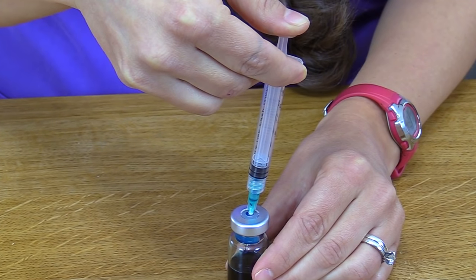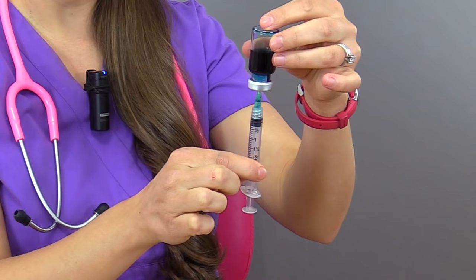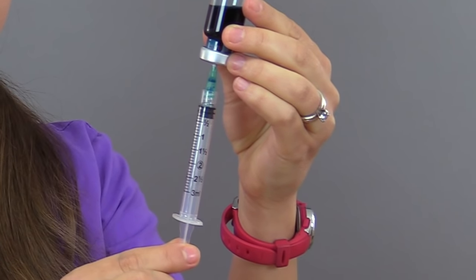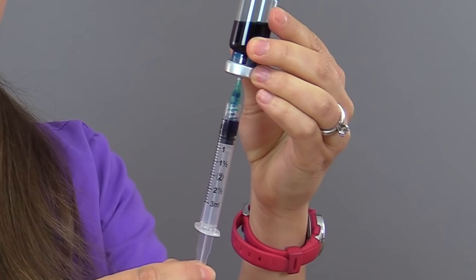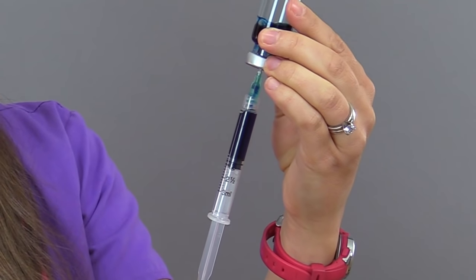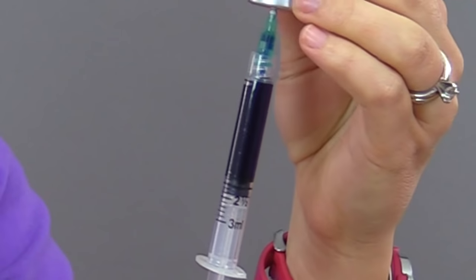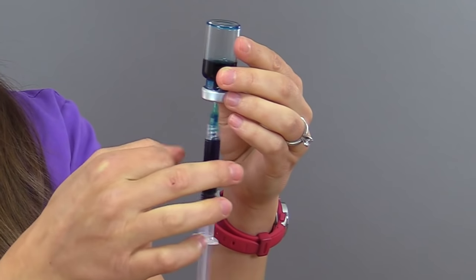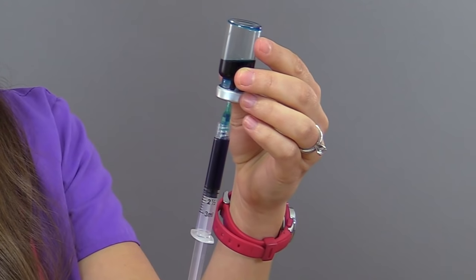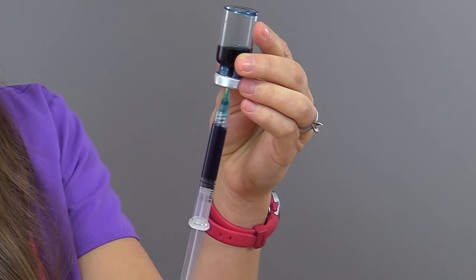Once the air has been injected into the vial, keep the needle access device in the vial. Invert the vial using the same hand positions — non-dominant hand holding the vial, dominant hand holding the syringe barrel. Once in position, move your fingers down to the plunger phalange and pull back until you remove two milliliters of medication, looking at the barrel markings to the two mark. Take care not to touch the shaft of the plunger — just the plunger phalange — and pull down to two. Now check for any air bubbles; if you see any, lightly flick the barrel to remove them, push them out into the airspace, then confirm you're at the two mark with the appropriate amount of medication.